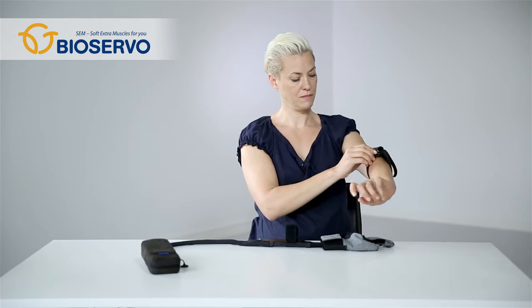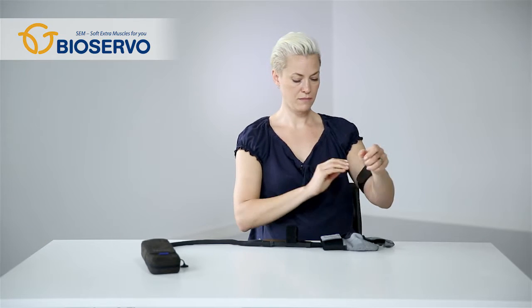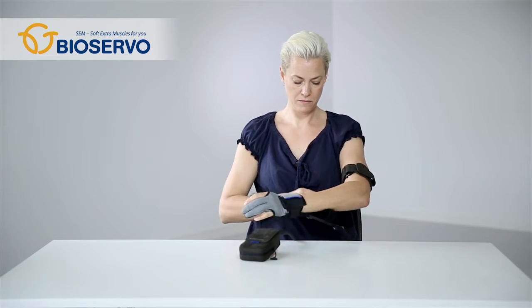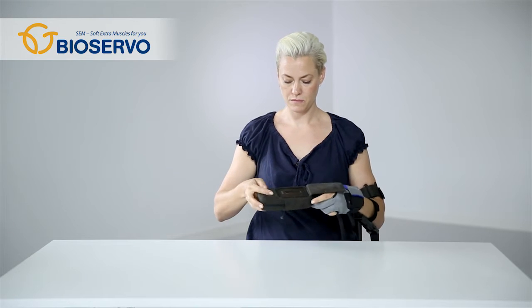Put the arm strap on your upper arm and tighten it to just the right size. Put the glove on the hand so that the thumb, middle and ring fingers are covered and the other fingers are free. Tighten the velcro around the wrist and then bend each end of the slap wrap so that it encircles your wrist.